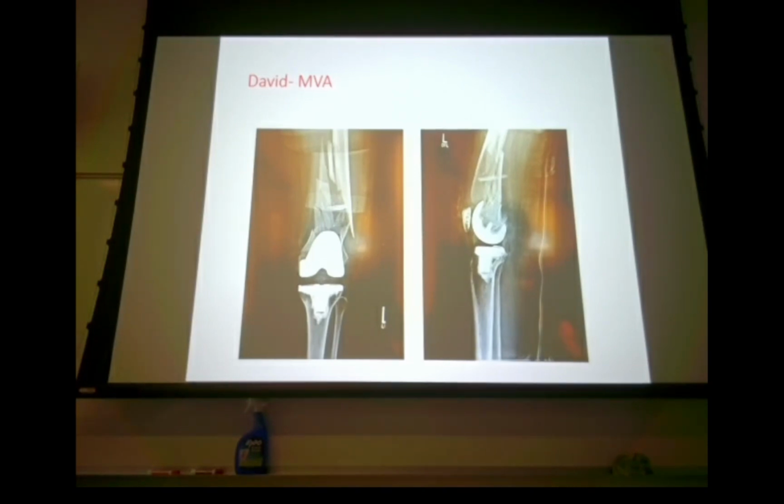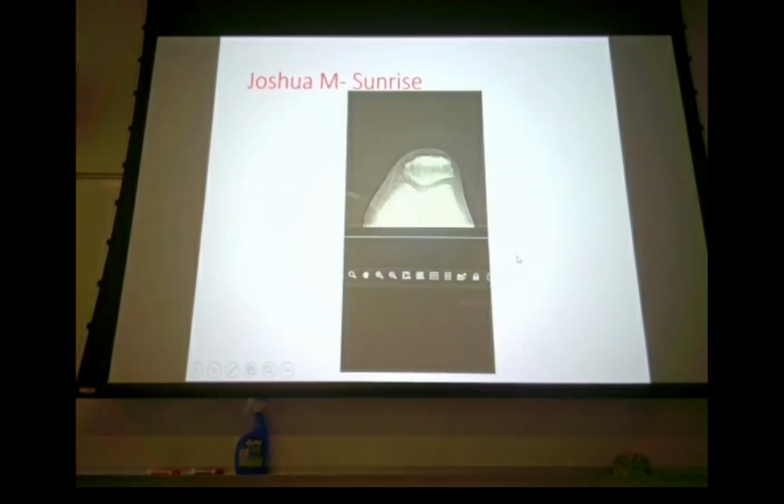Okay. So, was it anything? It doesn't look like it's compound. Anything poking through the skin? Yeah, it was open. It was open when she came in. It was an open fracture. Okay.